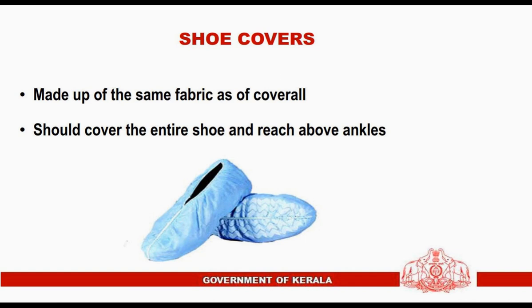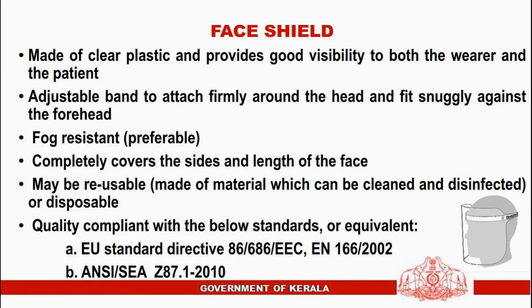Shoe covers. Made up of the same fabric as the coverall. Should cover the entire shoe and reach above the ankles. Face shield. Made of clear plastic and provides good visibility to both the wearer and the patient. Adjustable band to attach firmly around the head and fit snugly against the forehead. Fog resistant, preferable. Completely covers the sides and length of the face. May be reusable, made of material which can be cleaned and disinfected, or disposable. Quality compliant with the below standards, or equivalent.